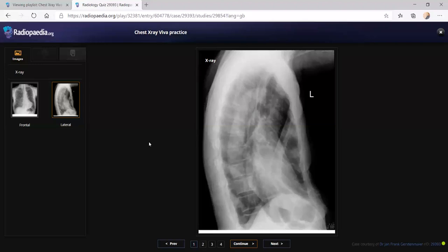So this patient, I could still see that there is a retrocardiac shadow, but I'm not sure at the moment. So what is the complaint the patient came with? Patient came with back pain. Okay. So what is your positive finding in the frontal radiograph? Well, the vertebra, but I can't see anything abnormal here in the vertebra. Are you retracting the statement, or are you keeping with the statement?